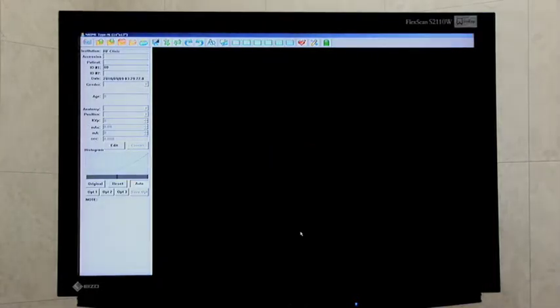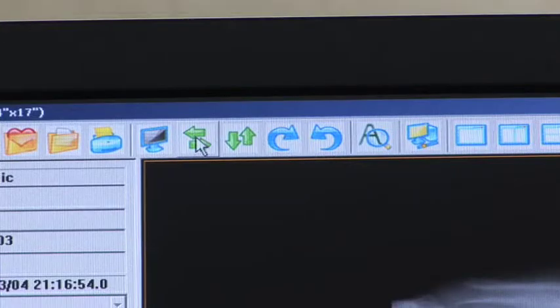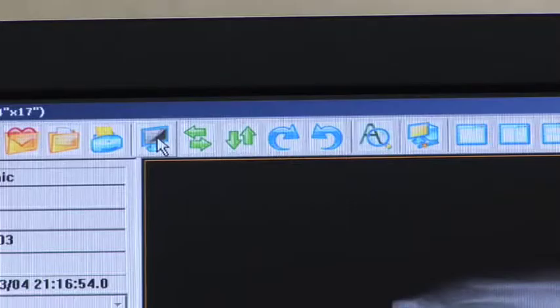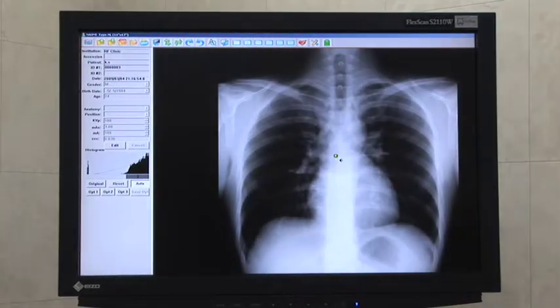The image is displayed as soon as it is saved in the computer. The software is designed to be used very easily. It enables you to do a lot of things with a single click of the mouse, like rotation, flipping the image over, changing the negative and positive image, and changing the brightness and contrast of the image.